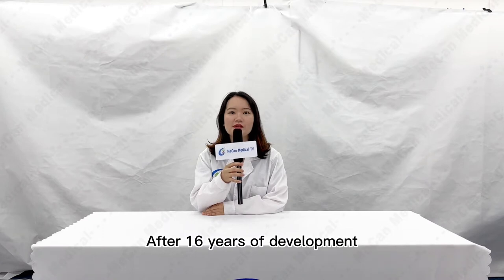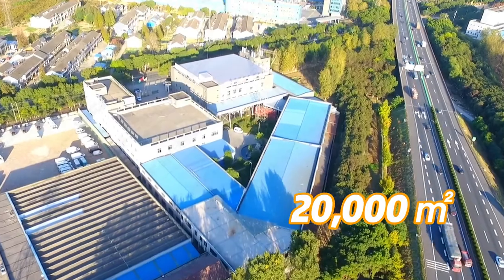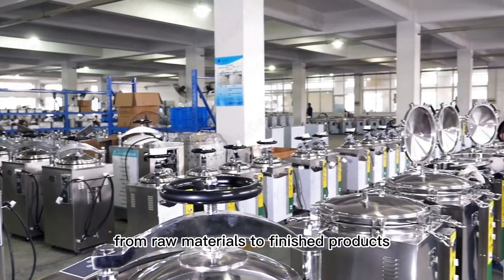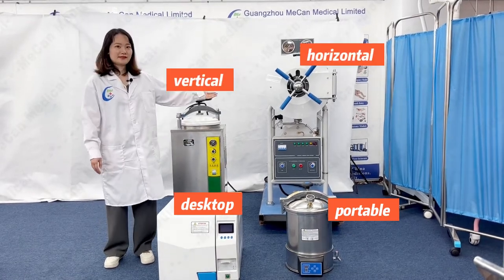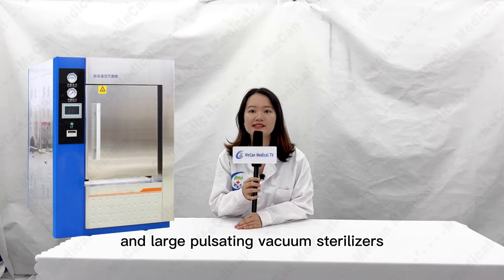After 16 years of development, our factory has a construction area of 20,000 square meters and has a complete production line from raw materials to finished products. The sterilizers produced include portable, desktop vertical, horizontal pressure steam, and large pulsating vacuum sterilizers.